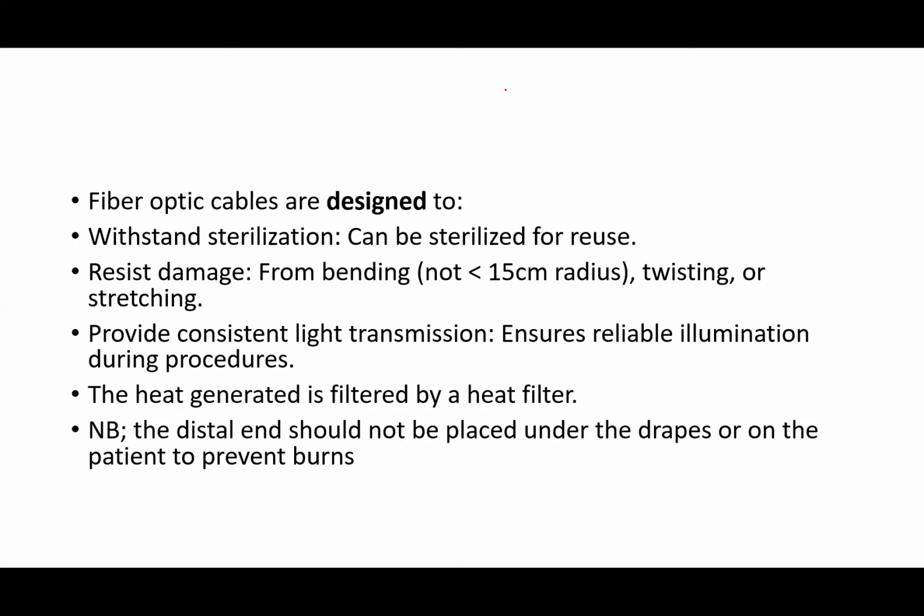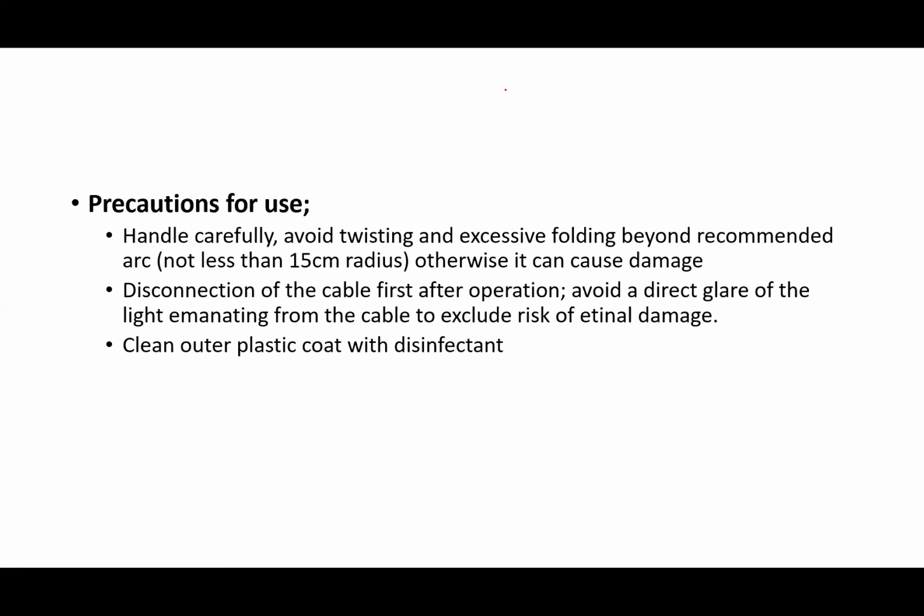The heat generated is filtered by a heat filter. And you should note that the distal end should not be placed under the drapes or on the patient to prevent burns. Now, these are some precautions of use. You should handle carefully, avoid twisting and excessive folding, as we mentioned, beyond the recommended arc, not less than 15 centimeters radius.